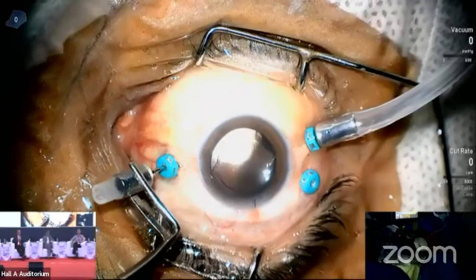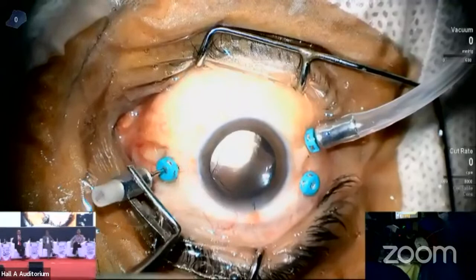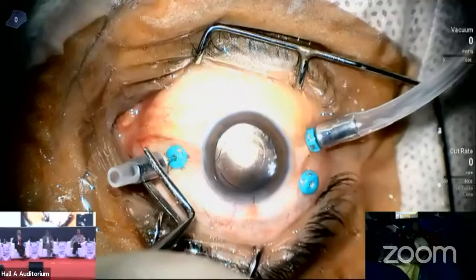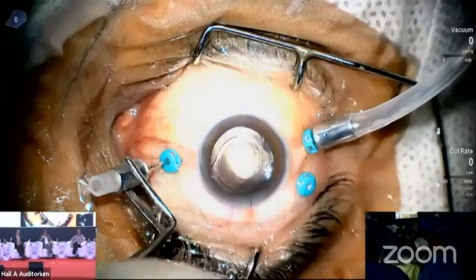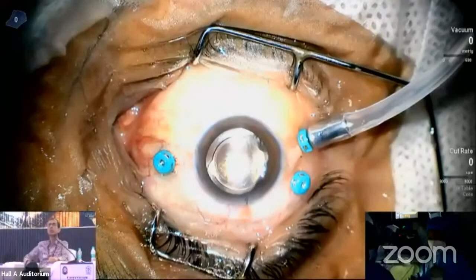So it is said that if you flush the vitreous cavity with around 33 to 34 ml of gas mixture, it will totally replace the vitreous cavity with the gas mixture. So we usually inject it with the help of a 50 cc syringe. From the infusion cannula, right now the assistant is injecting gas. A 50 cc syringe has been attached to it at the concentration which Dr. Vinod said. So I'll start removing the ports one by one.